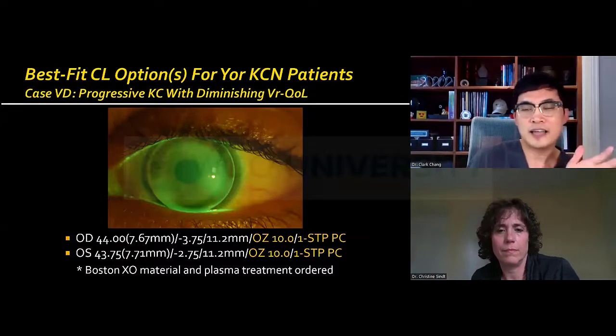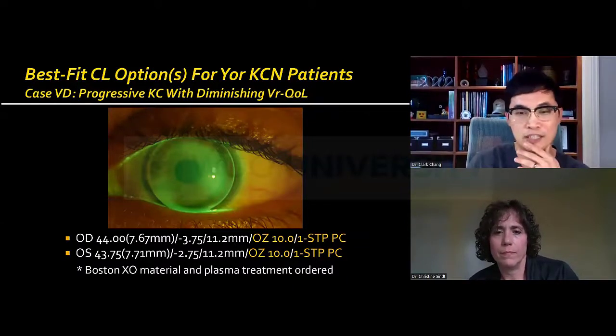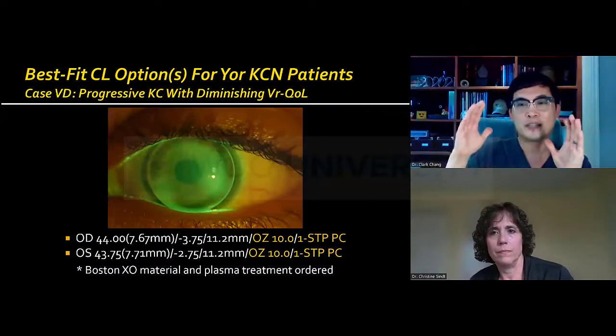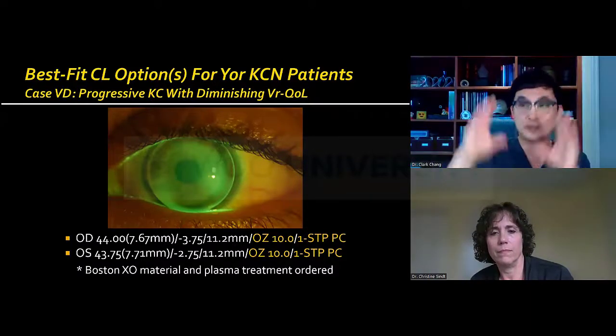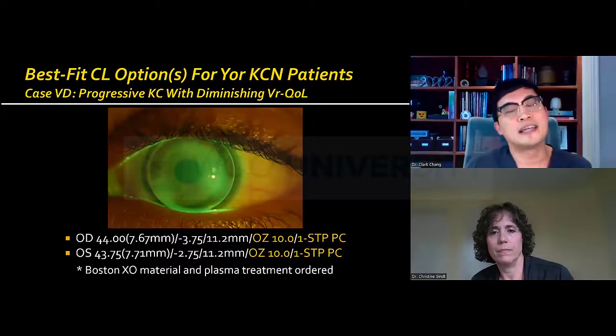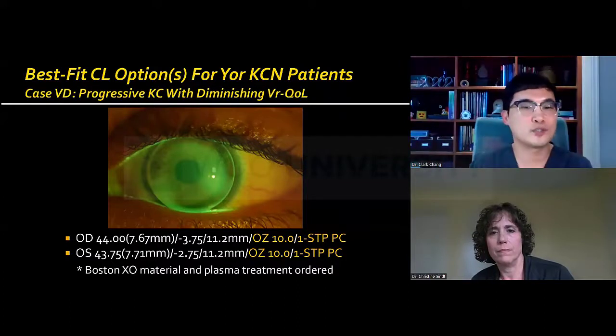There's less halo and glare, but he still sees it, especially at night, and he still finds it very non-functioning, no matter how I tried to go slightly steeper with the lens to make sure that it doesn't move as much as a normal GP, but still have tear exchange, and thinking a larger OZ would always be inclusive of his visual axis, despite the larger pupil.